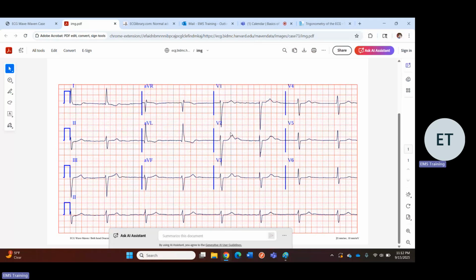It's not super wide. This could be some sort of junctional rhythm, I suppose. And it looks like there's U waves after the T wave. Ooh, U waves, no P waves in a weird looking QRS. This could be like a hypocalcemia, prolonged QT. I'm going to say that this is an electrolyte disturbance. Oh yeah, this is a calcium issue. Oh, look at that U wave. I don't see any Osborne waves. I was going to say it always could be hypothermia. Never sleep on hypothermia.